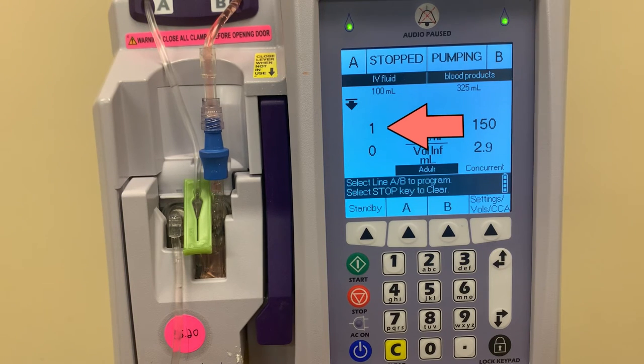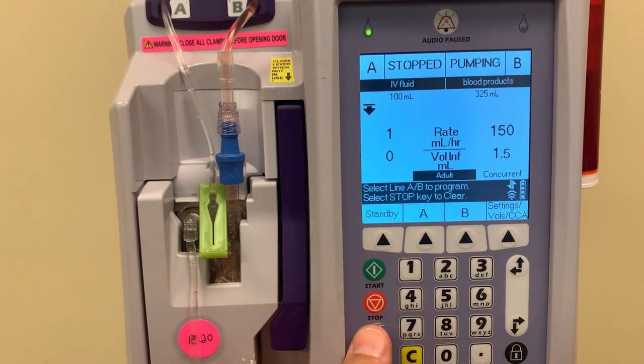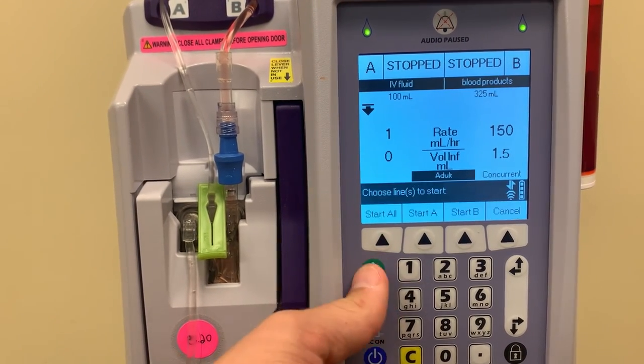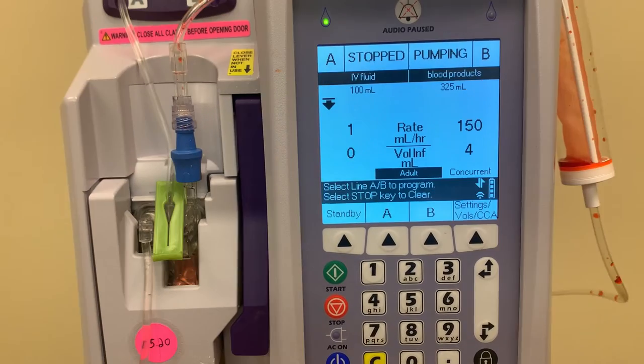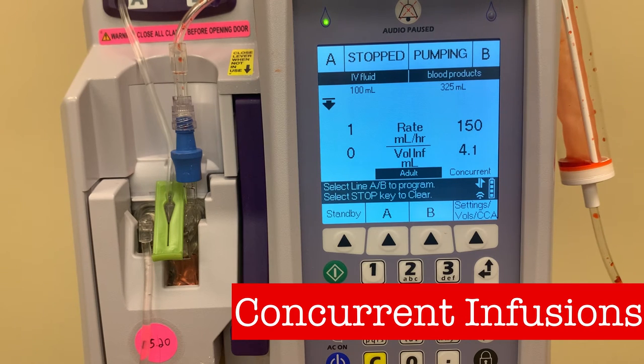We programmed the A line to run at 1 milliliter an hour just in case this step is forgotten, or in case another nurse responds to an occlusion alarm and mistakenly chooses start all when they restart the pump. The advantage to having the blood run as concurrent is that if the blood bag runs empty, the infusion will stop and an alarm will sound alerting the nurse to the completed infusion. If it were set to a piggyback, after the blood product finishes it would automatically start up the A line and not alert the nurse to the completion of the product.